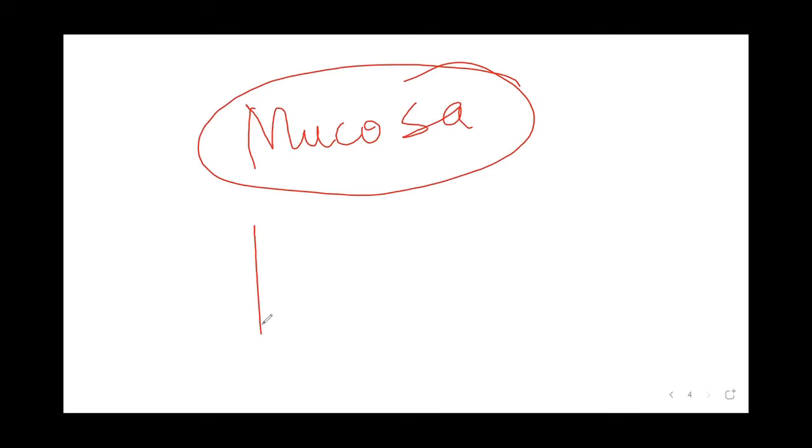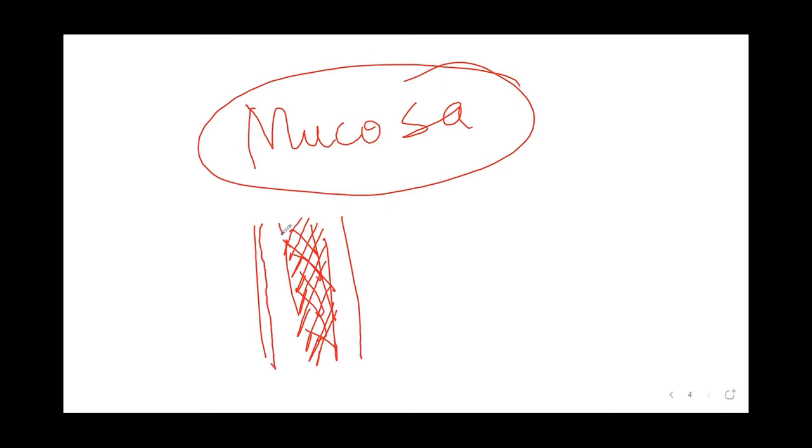So if you have a bowel, okay, you have the barium in the lumen, okay, and the air between the barium and the wall of the bowel, okay. So it's a double contrast. Now, the double contrast will give you a better anatomy of this mucosa. If there is any lesion on the wall, it will show you a better outline.